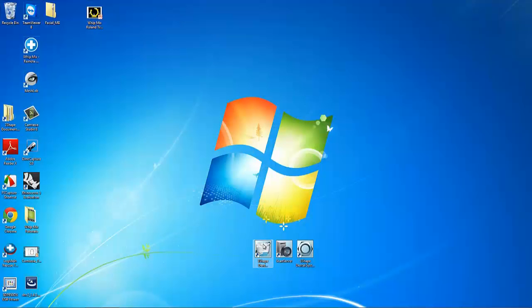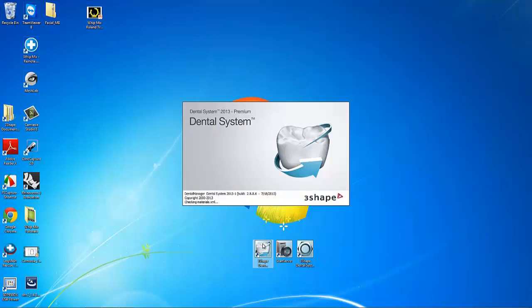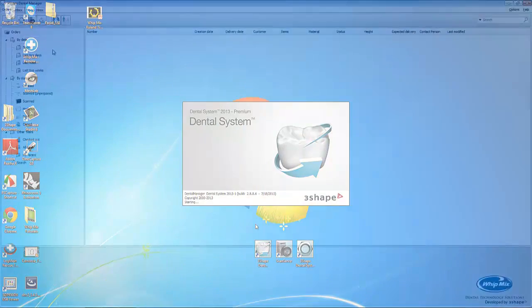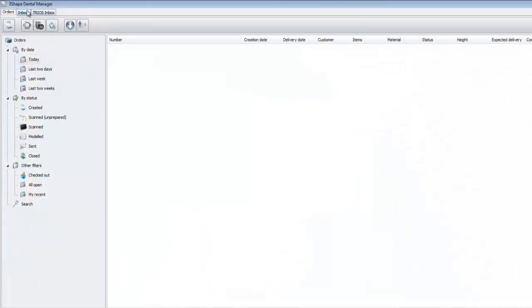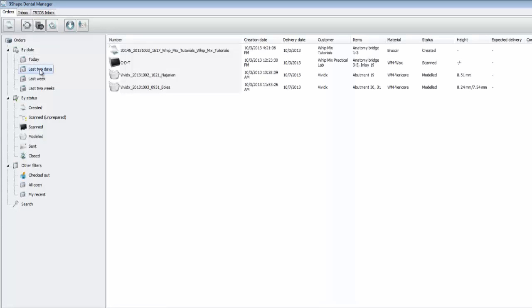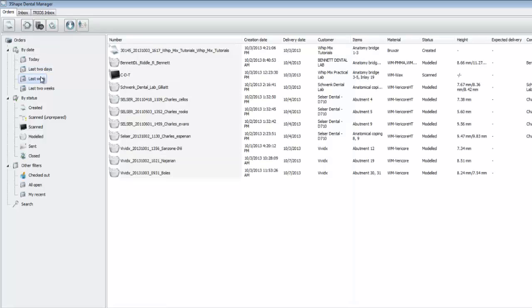To begin, let's open the 3Shape Dental Manager. Once the software opens, you'll see that there are quite a few different things we can do. We can sort the date by today, the last two days, last week, and last two weeks.